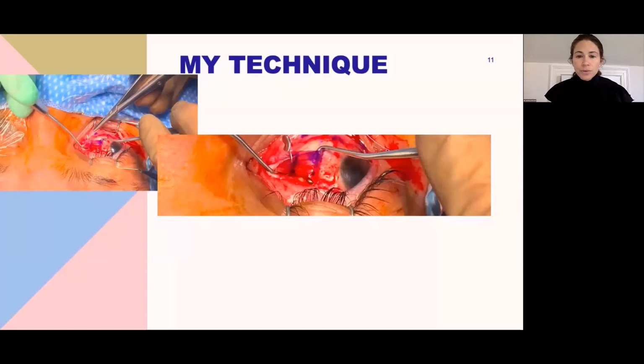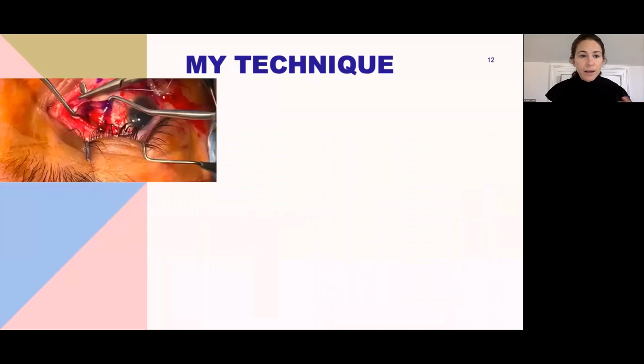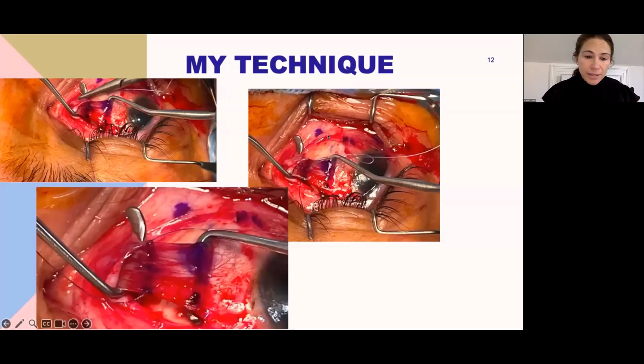And so here I'm showing you the partial thickness passes. I try to do it just behind my line. Again, avoiding going in on a vessel. And then I go in the other direction and then I lock. To do my full thickness bites and lock, it's important to identify where the vessels are. So you can see this very large one here. On the other side, there's a big ciliary vessel here. So I do my full thickness locking bites and try to avoid the ciliary arteries.